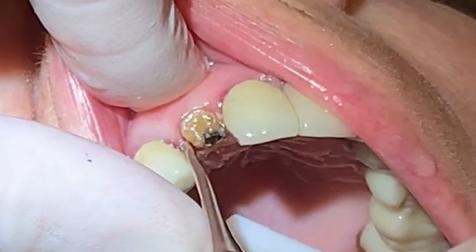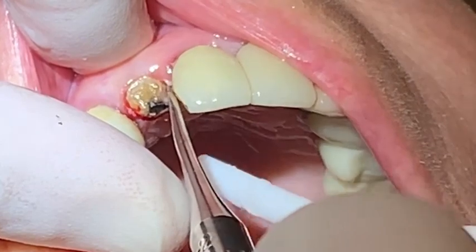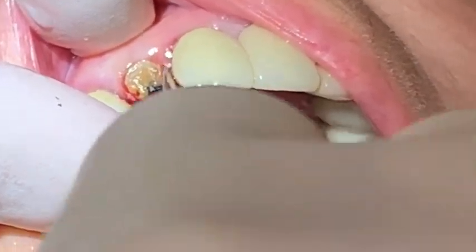Once the piezotome has reached the apex or is near the apex, a small periatome is used to create movement, followed by forceps removal from the socket.